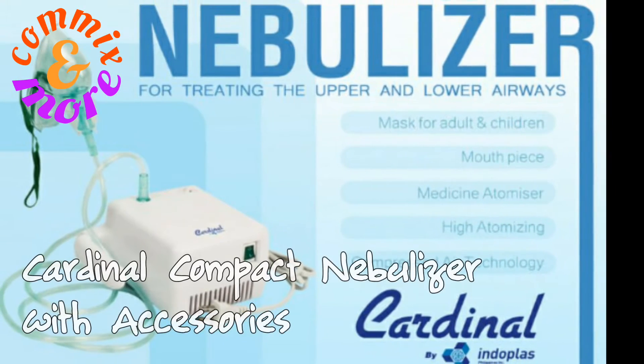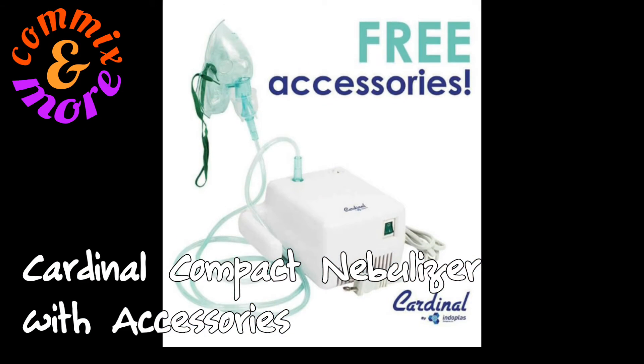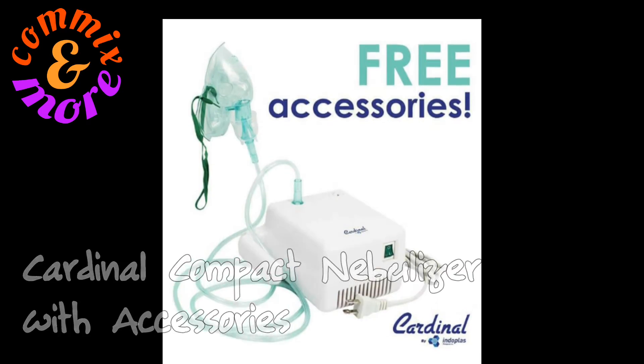In this Commix and More video, we are going to unbox and see the contents of the compact nebulizer by Indoplas, sold in Lazada.